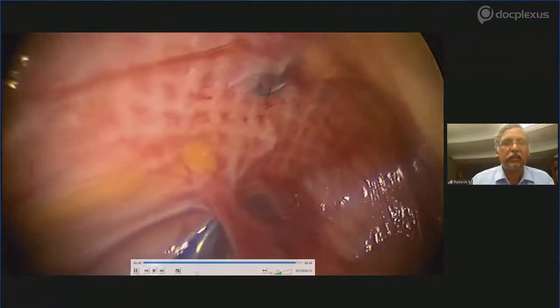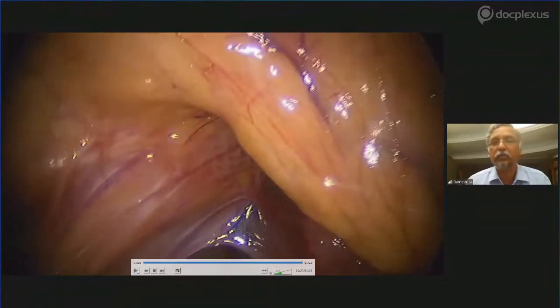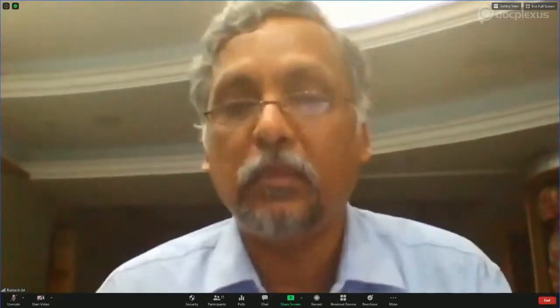This is something I wanted to show, because at the end of the surgery I put in a port and looked inside the abdomen. It was a real mess. All these years, we would go in and dissect out all these adhesions. You can see the mesh here, and it's all covered densely with adhesions. It would have been such a big mess if we had really had to do a regular IPOM for this patient.